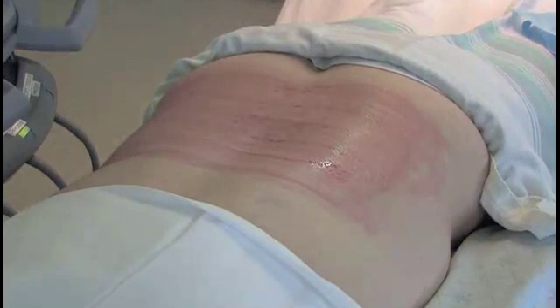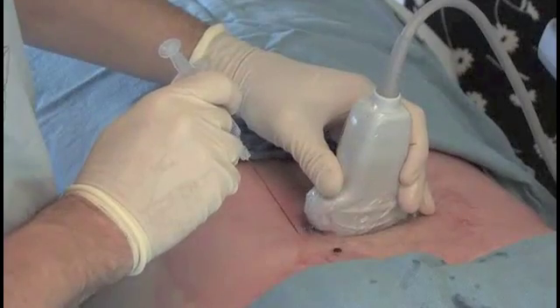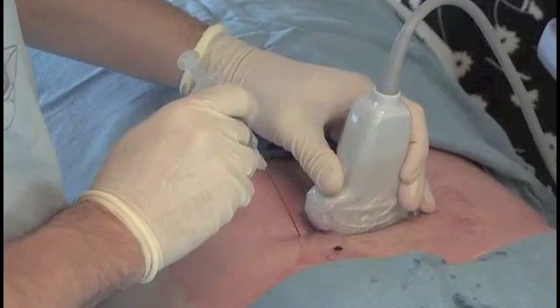After sterile skin preparation, a 25-gauge needle with one milliliter of one percent lidocaine is used to raise a wheal of anesthetic at a point approximately six centimeters lateral from the midline. A 22-gauge, 8-centimeter spinal needle is introduced through the wheal.